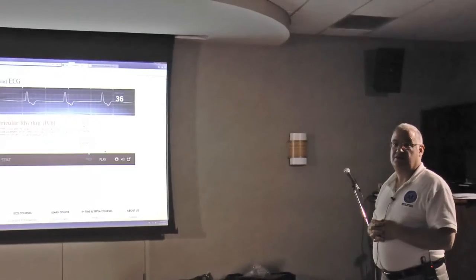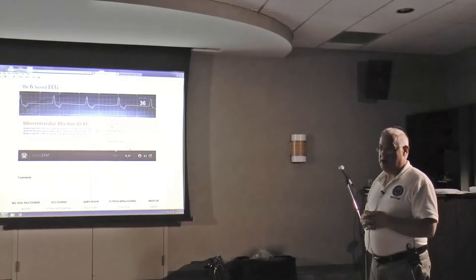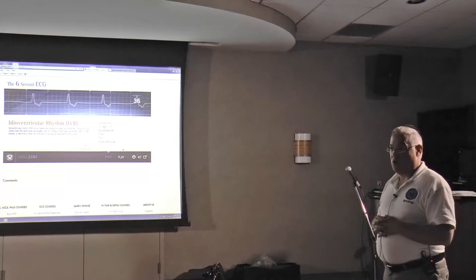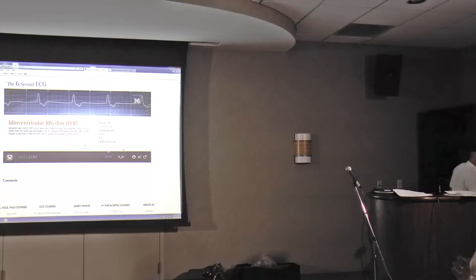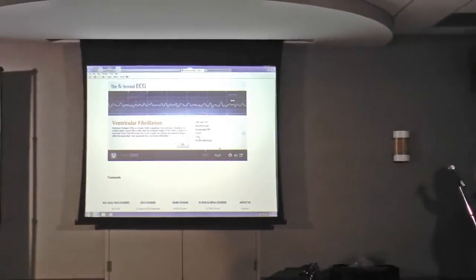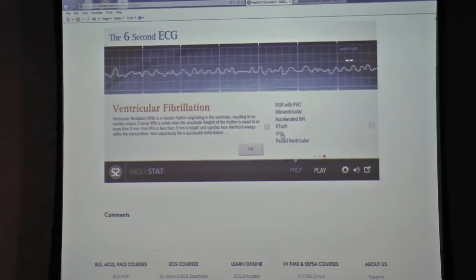What's the rate that you would call it VFib? No rate, zero rate. So VFib has no heart rate. VFib is just the ventricles shaking and quivering. There's no organized electrical activity, there's no rhythm, there's no rate, there's no nothing. It's total death. Right, so if you had VFib, and again, this would be probably a fine to moderately, possibly coarse VFib. So none of those little complexes are actually contracting. That's just the muscle of the heart shaking.